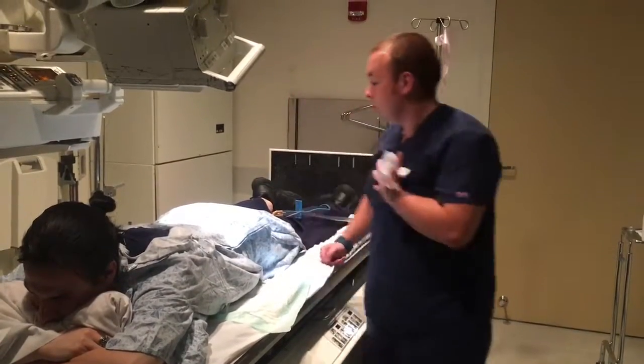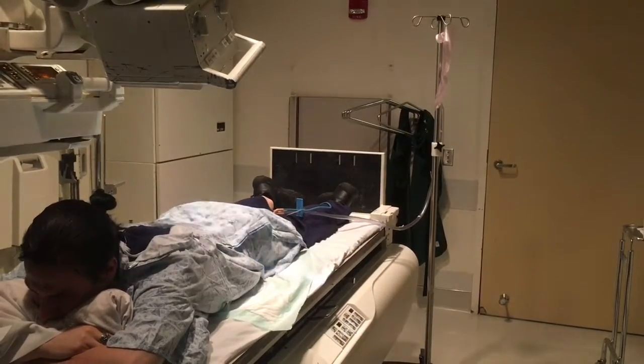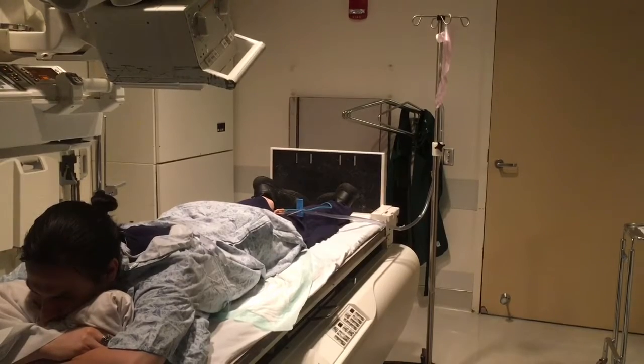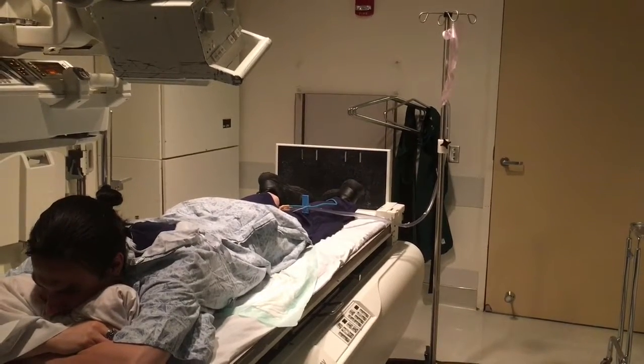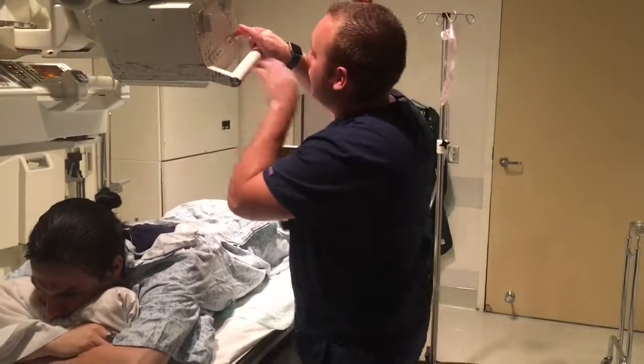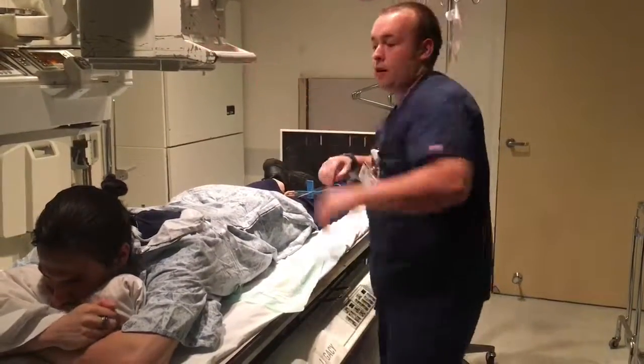Alright. Looks good. Take in a deep breath. Blow out. Hold. X-ray. Breathe. Alright, just a few more images, sir, and you're going to be out of here. Next, we're going to go for our decubs.